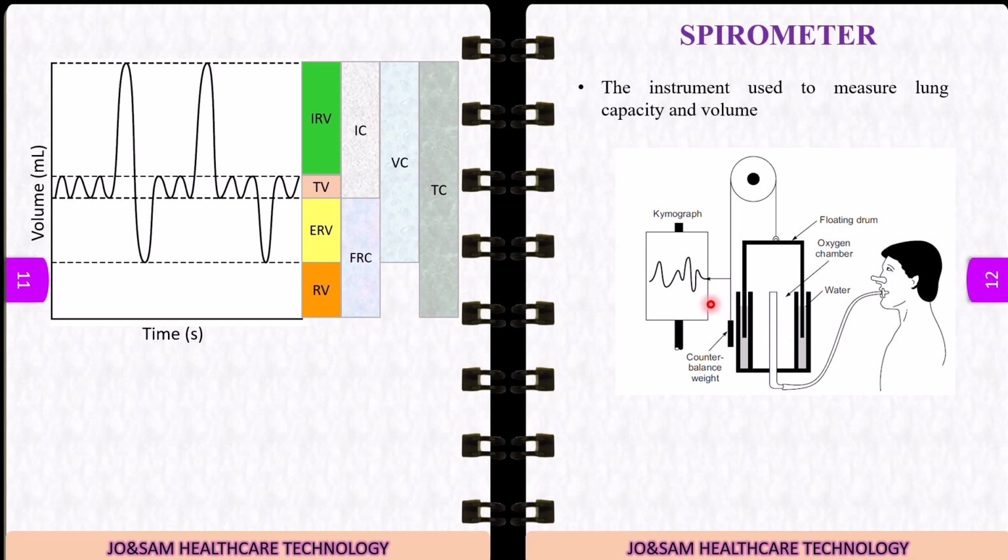When the weight is attached to a potentiometer, an electrical signal is produced as output. The output produced by the pen and the electrical signal are almost similar results. So nowadays we don't have such kind of spirometers. We have electronic versions of spirometers. There, sensors or transducers can be used, where the air flows from your mouth; that is, you blow on the sensors. The sensor may be of different types, say a turbine sensor, pressure differential flow sensors, or ultrasonic sensors.